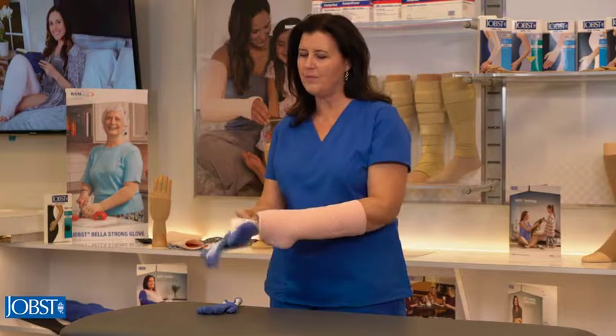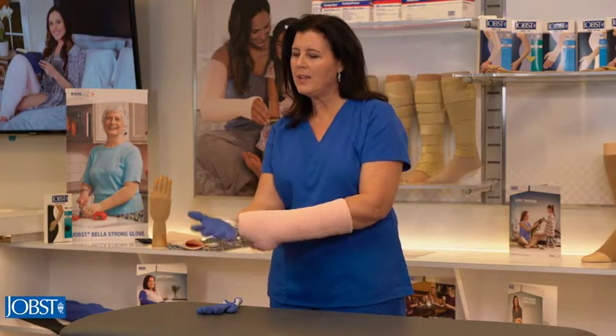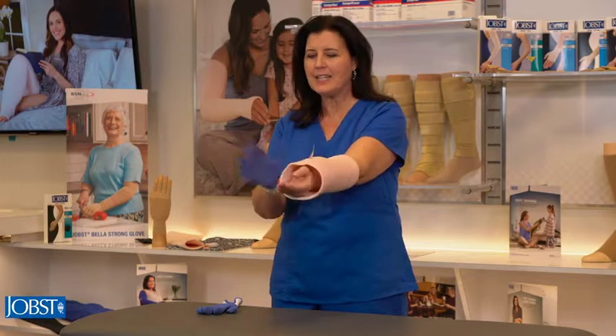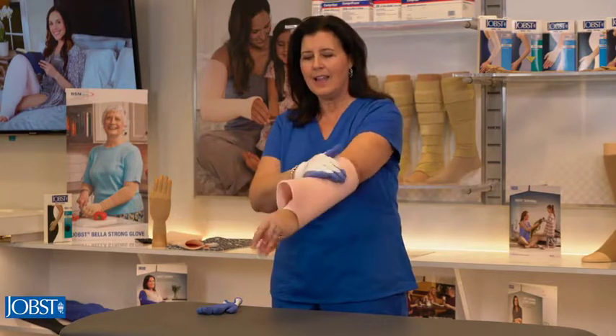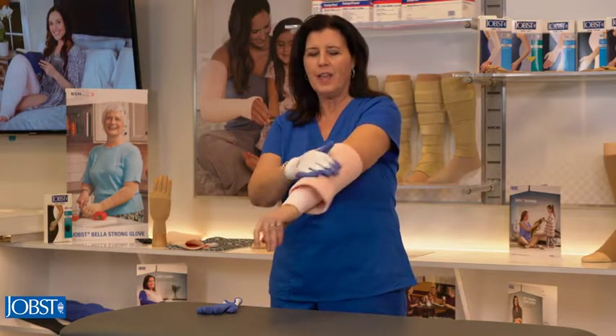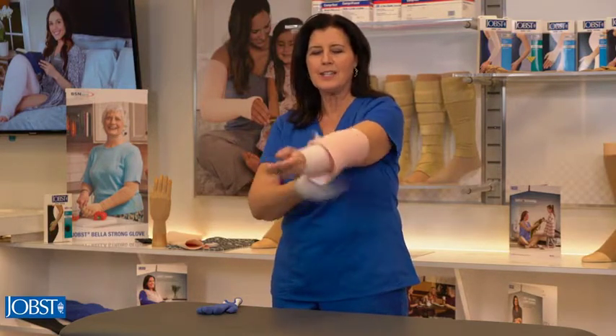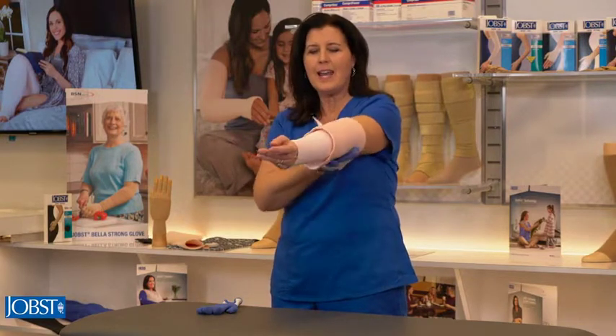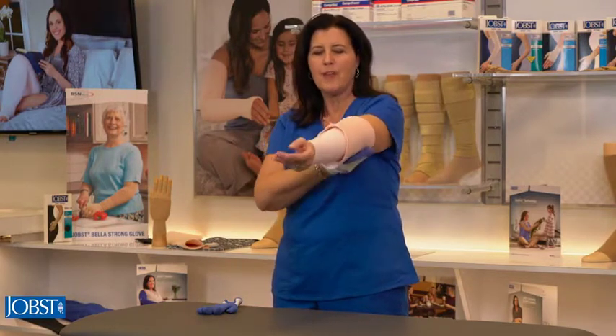Then I'm going to put on my glove. Using an open-handed technique, the tackiness of the glove is going to move the fabric up the arm. I want to continue to do this until I get past the elbow — once I get up past the elbow, move that fabric up.